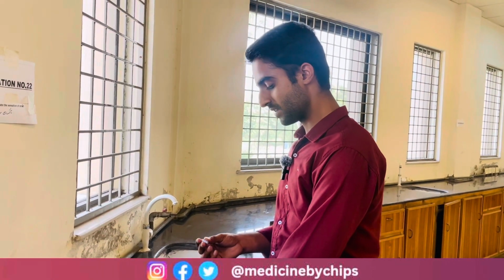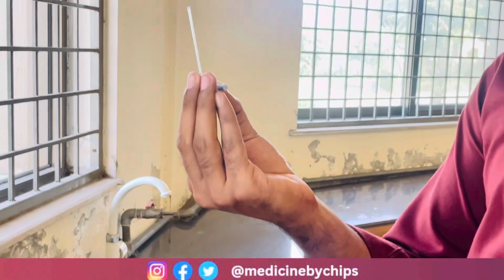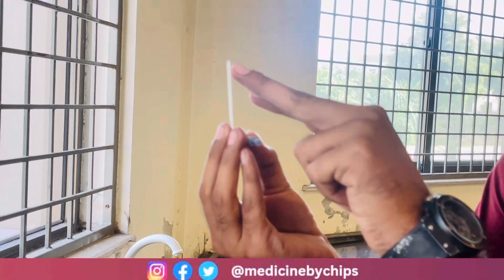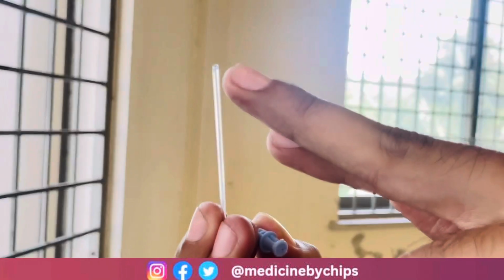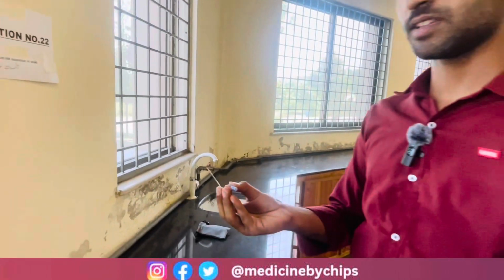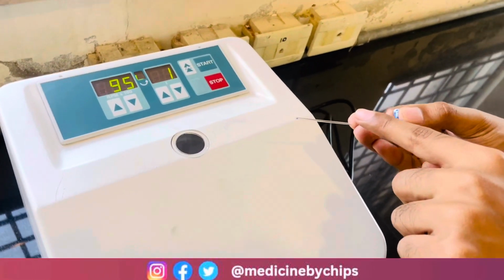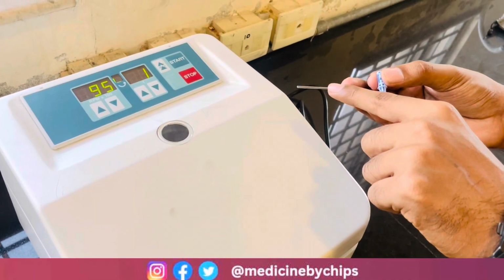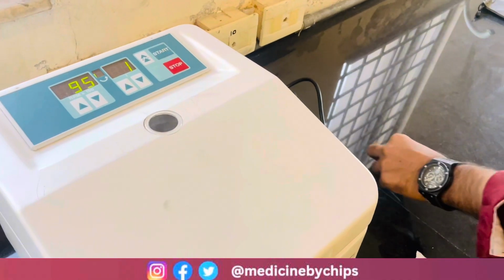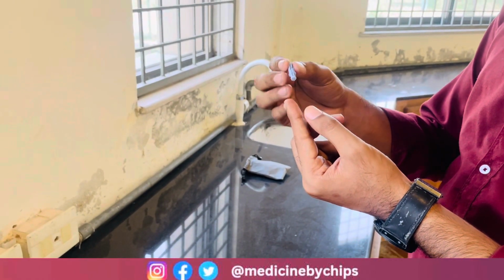Now we will perform the experiment of the determination of hematocrit. This is the sterilized lancet, which is used to prick the finger, and this is the capillary tube. You can see that there is a mark, and we put it on the blood so that the blood comes into the capillary tube due to capillary action. This is the microhematocrit centrifuge machine in which we put this capillary tube. First of all, we will use a lancet to prick the finger.